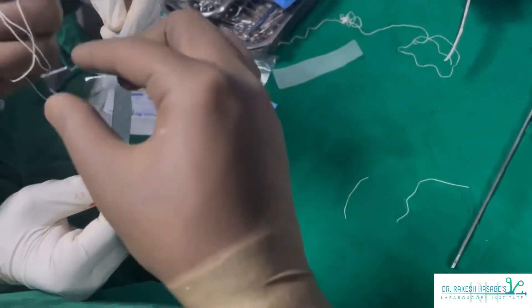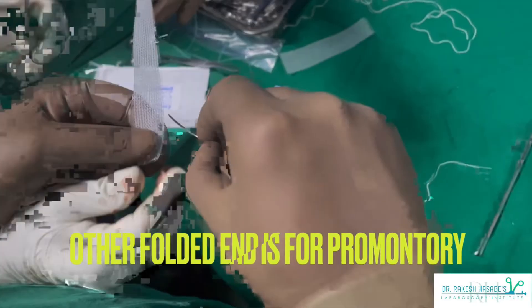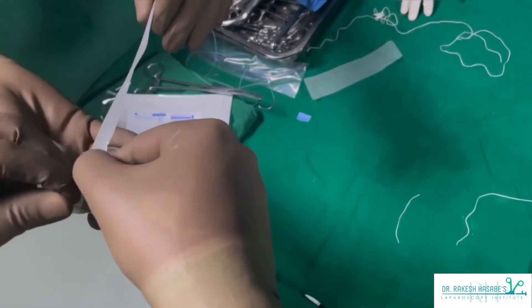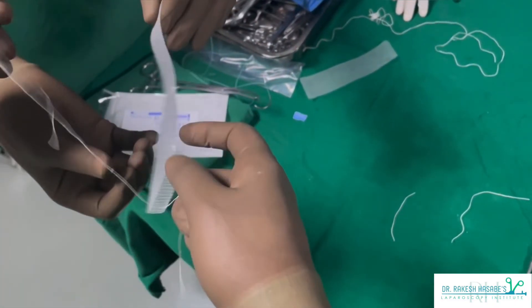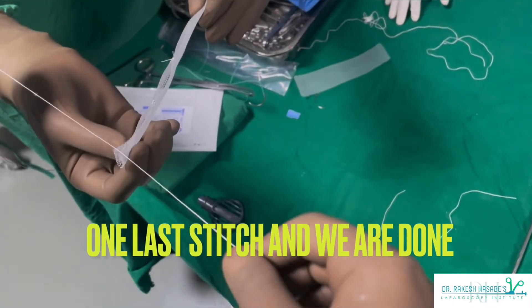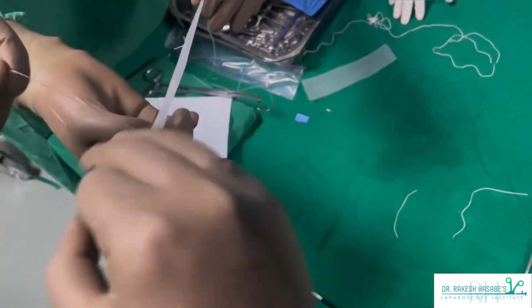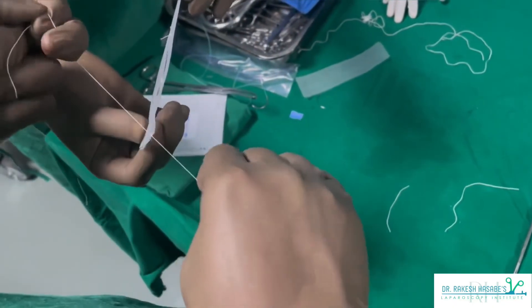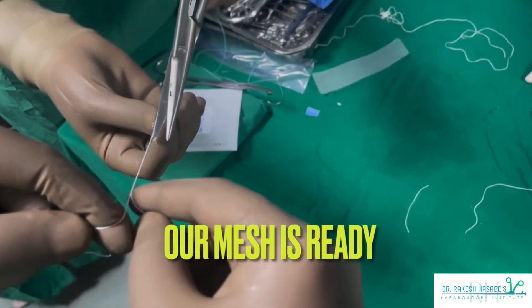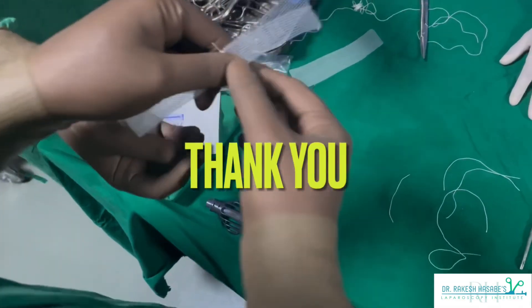All other surgical aspects will be covered in part two, where I will exactly demonstrate how to fix the mesh with the sacral promontory and also with the vault. As you can see on the screen, I have divided one end of the mesh into a Y-shaped sleeve. To avoid difficulties during surgery, I have folded the remaining part of the mesh and tied it using plain linen suture. That's it — our mesh is ready. Stay tuned for part two, thank you.